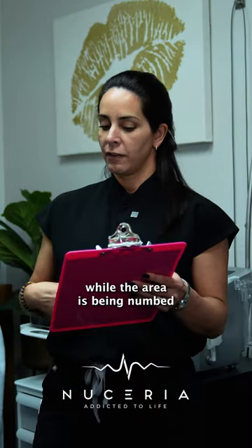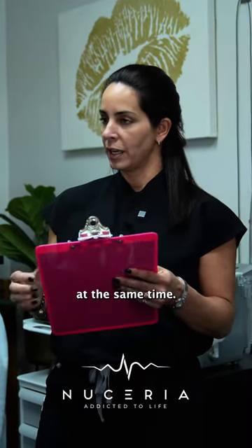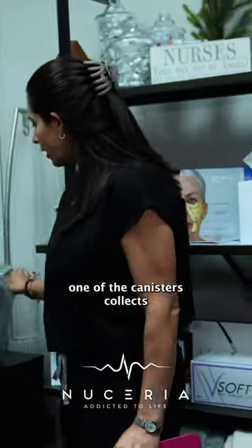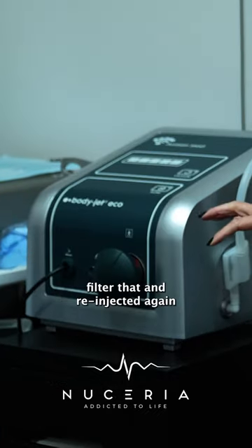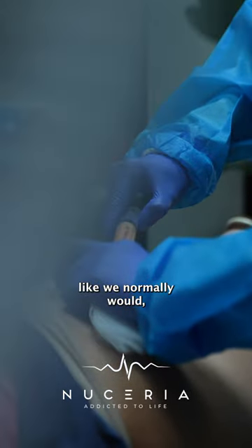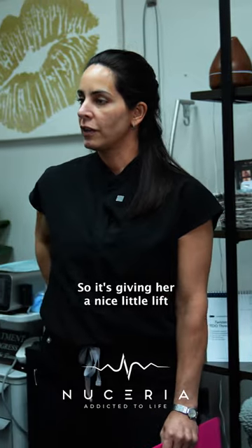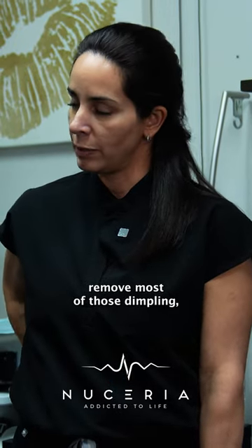There isn't any discomfort while the area is being numbed or while the liposuction is going on, which happens simultaneously at the same time. One of the canisters collects the fat that we suction, and then we're able to filter that and re-inject it. So if we're looking at the dimpling area, we would inject it like we normally would — targeting those specific dimpling areas — giving her a nice little lift at the same time and removing most of those dimples.